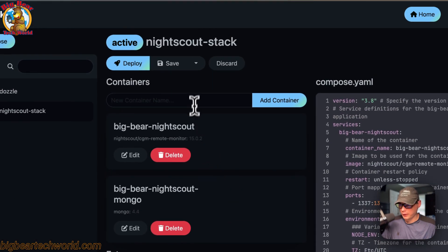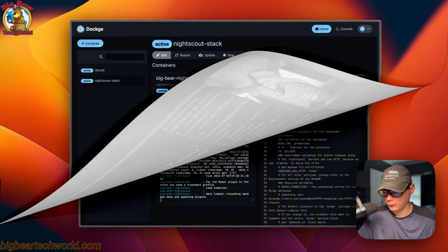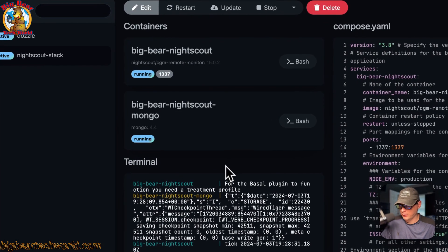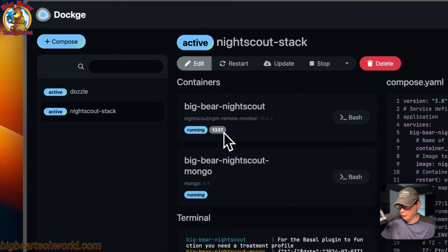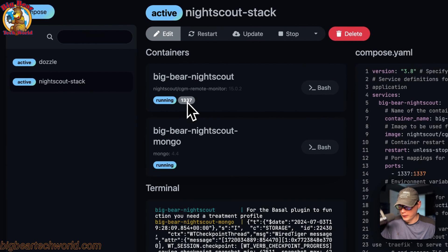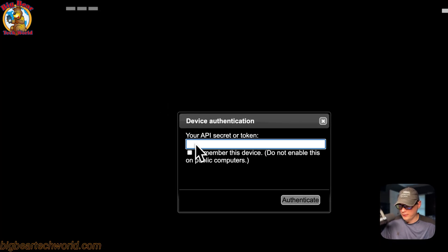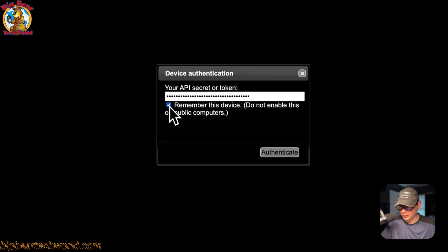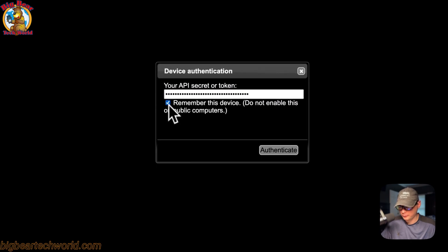Now we're going to go over to the UI and log in. Now that we have the API secret, we can go ahead and log in. From the Dockage stack view for Nightscout, click the stack, go to Ports, and click port 1337. You'll now see the API secret or token field — paste your API secret in here. You can also check the box to trust your current device, then press Authenticate. We are now logged in to Nightscout.